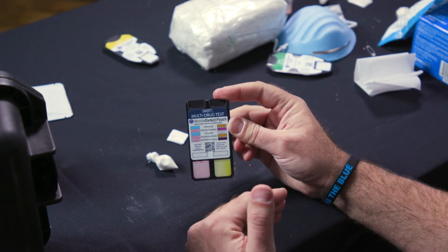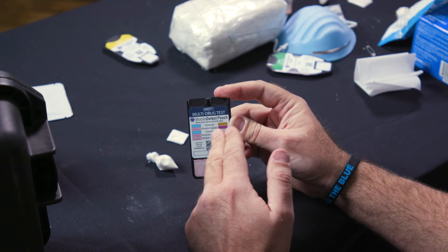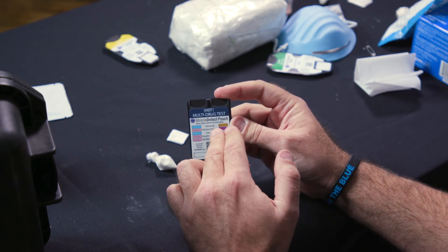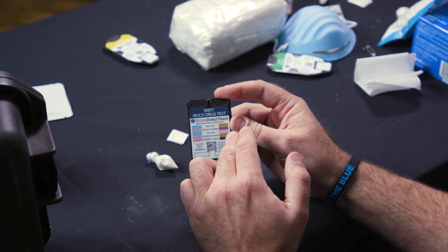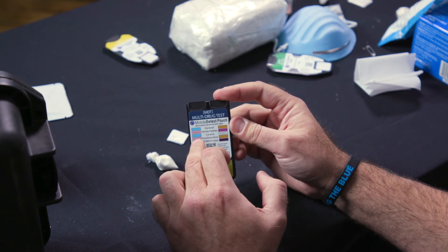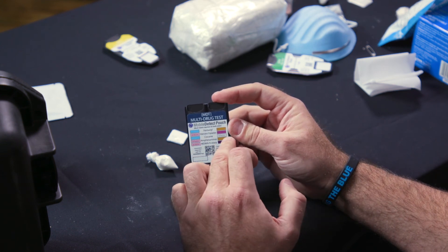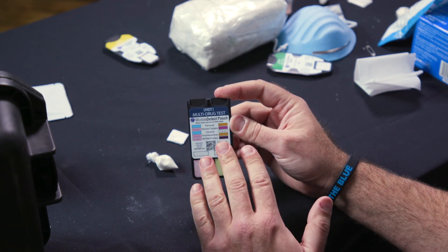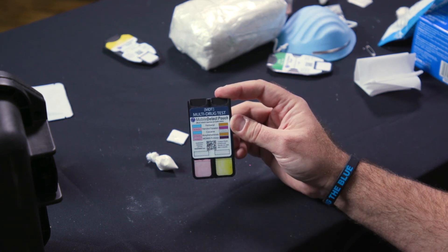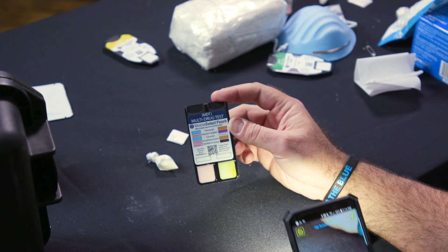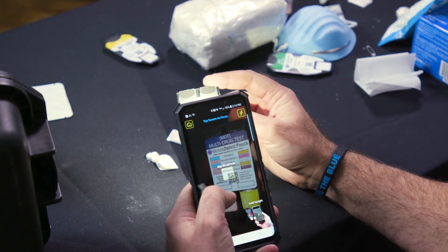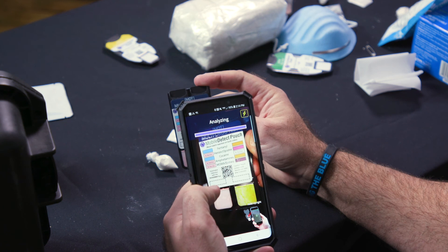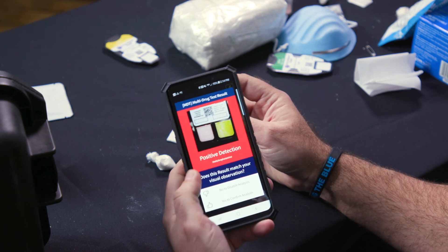You want to follow the legend up here. The app automates this process, but by looking here you can see right off the bat what type of drug you might be dealing with. Fentanyl being blue on the left, orange on the right; cocaine being just blue on the left, no reaction on the right, and so forth. Once you've gotten to here, you have about three minutes to use the app. Go into the Mobile Detects app, line up the QR code, and you'll get your detection right away. That's it.